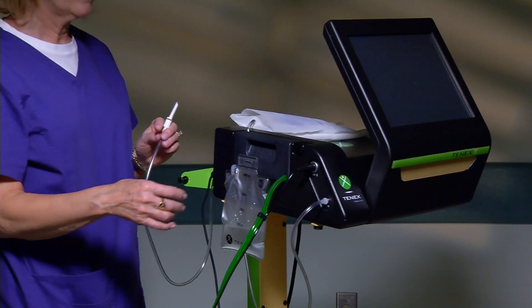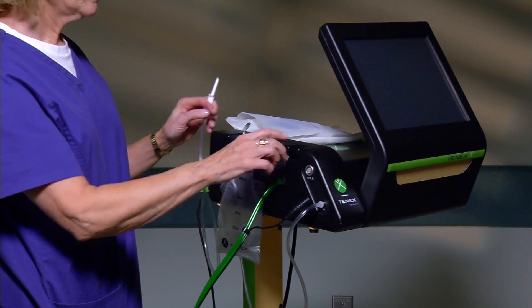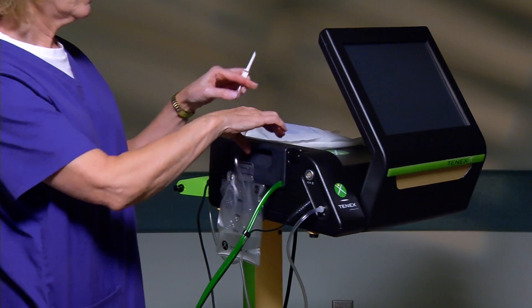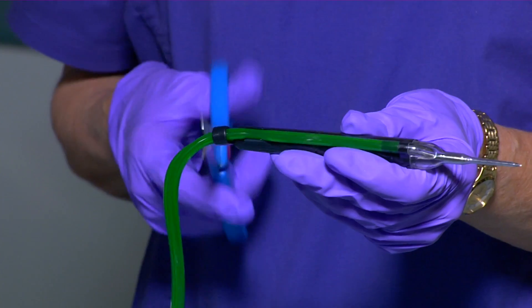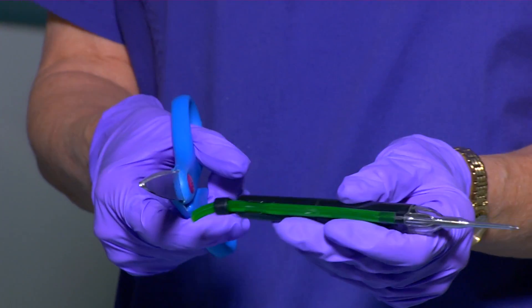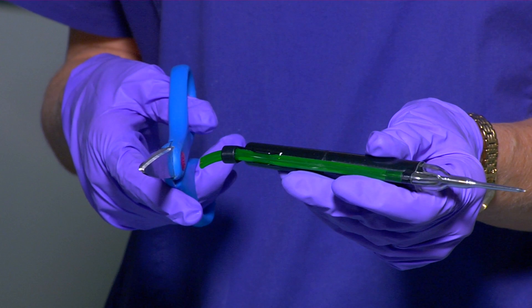Disconnect the TX micro-tip electrical connector from the cut receptacle on the side panel. Depress the cartridge release button and remove the cartridge from the side of the console. Cut the tubing with scissors at the base of the TX micro-tip and dispose of the TX micro-tip in a sharps container. Dispose of the cartridge and remaining tubing according to facility regulations.